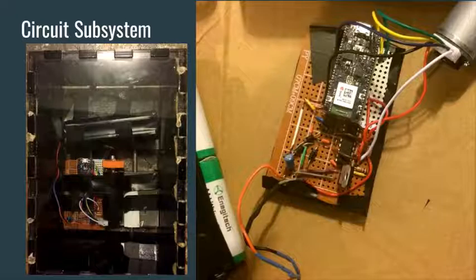So we have our battery pack, which consists of 8 AA lithium batteries that power the DC motor and the Arduino. We have the DC motor with an encoder, which has the gear attached to the end of it, and turns whenever the Arduino sends a signal, which is based on the programming system, which Hannah will go into detail later. The DC motor is what widens the expander and causes the palate to widen, so it supplies enough torque, which supplies enough force to widen the palate.